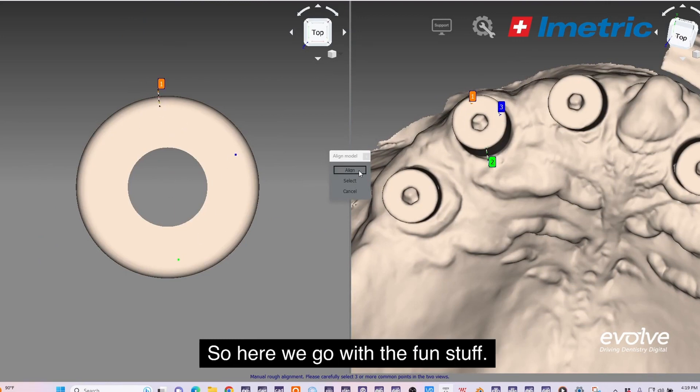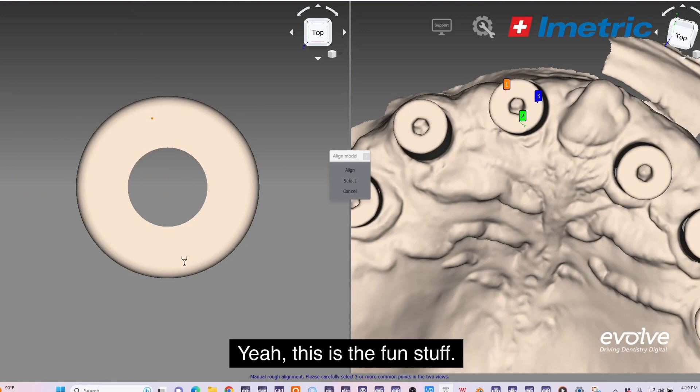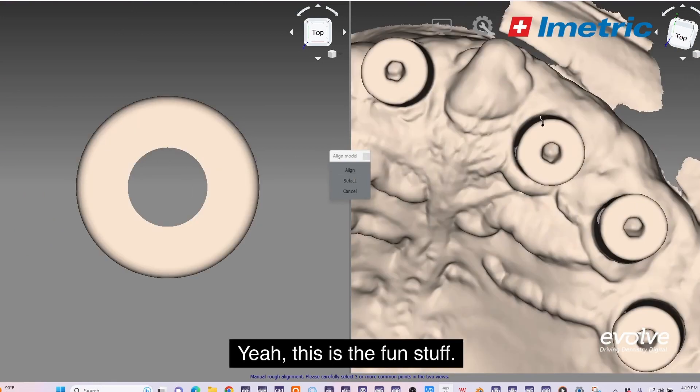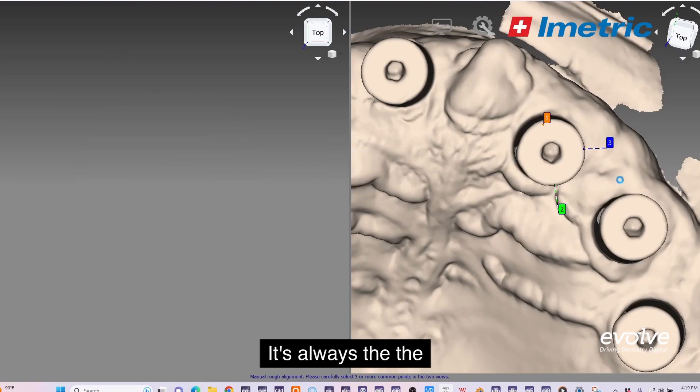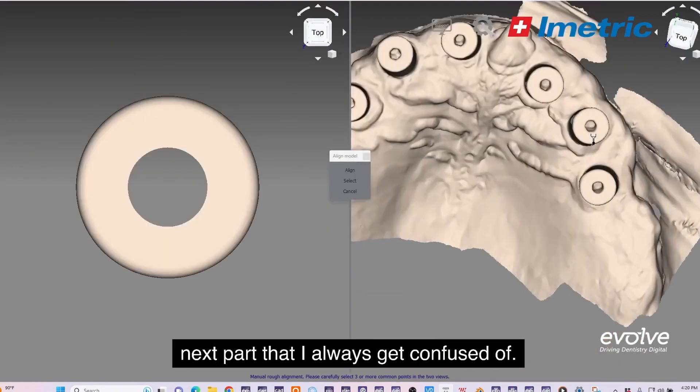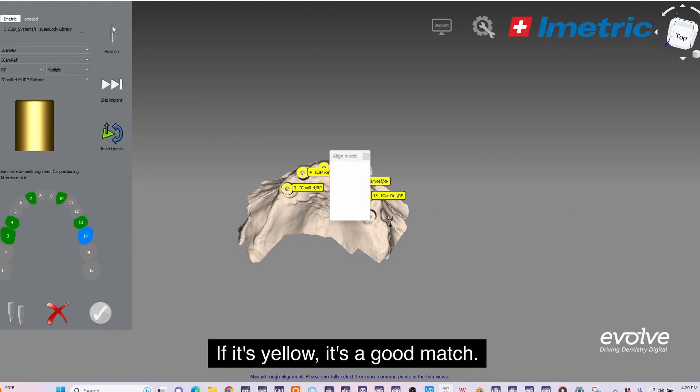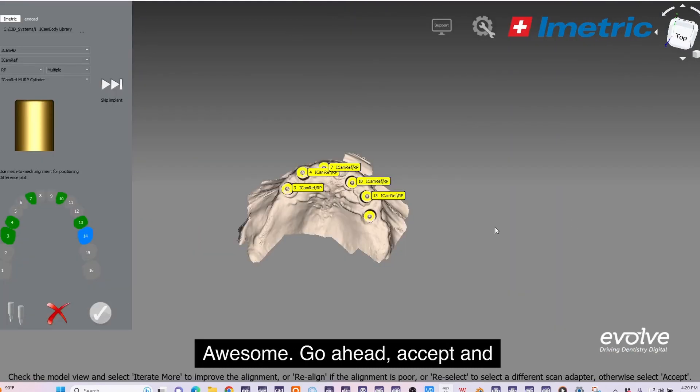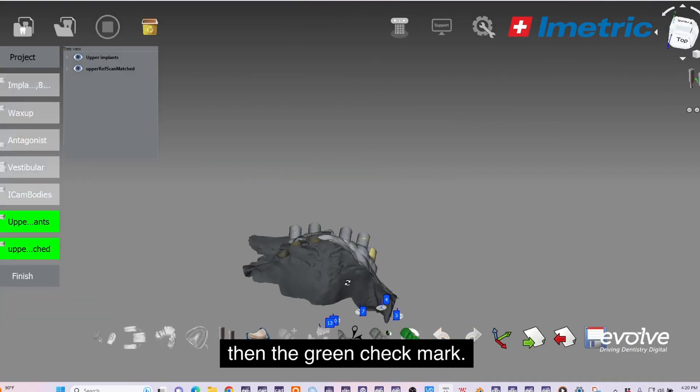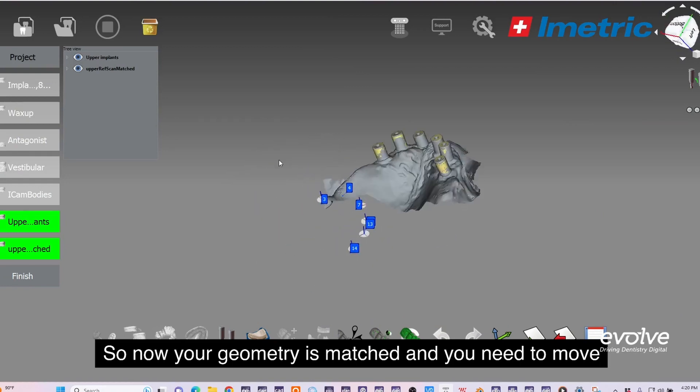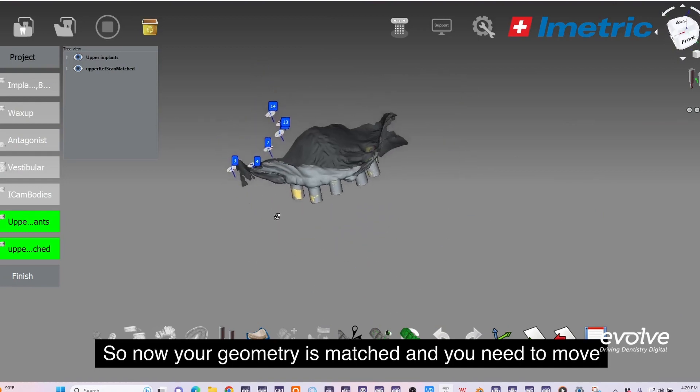This is the fun stuff. If it's yellow, it's a good match. Accept and then the green check mark. Now your geometry is matched.